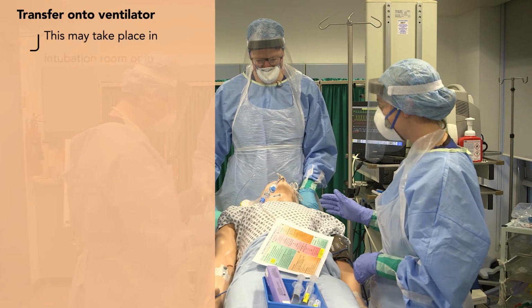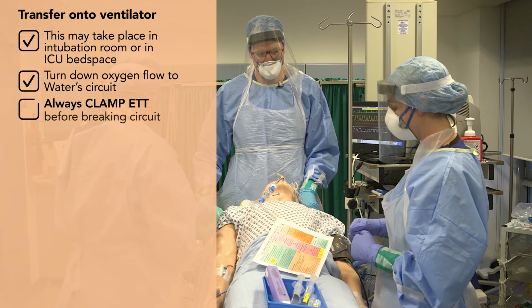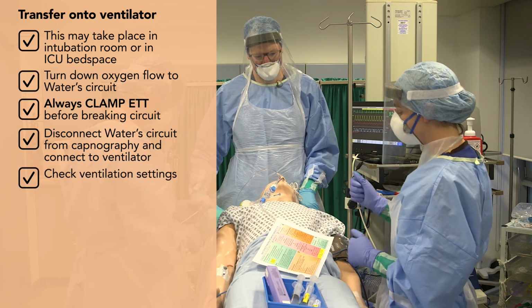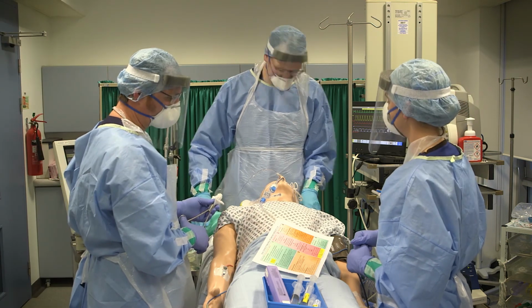So we're going to turn down the oxygen to the water circuit. We're going to clamp the ET tube before we break the circuit, and then we're going to disconnect the water circuit from the capnography, connect to the ventilator, and then unclamp the ET tube before we start ventilation. Okay. Everyone happy? Yeah. Okay.